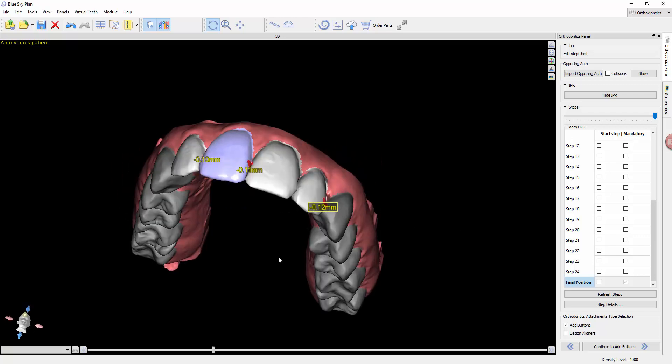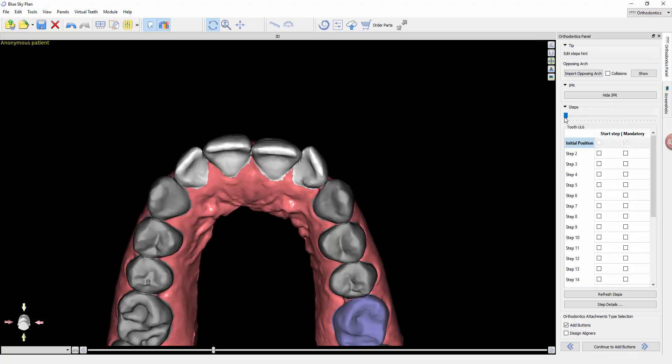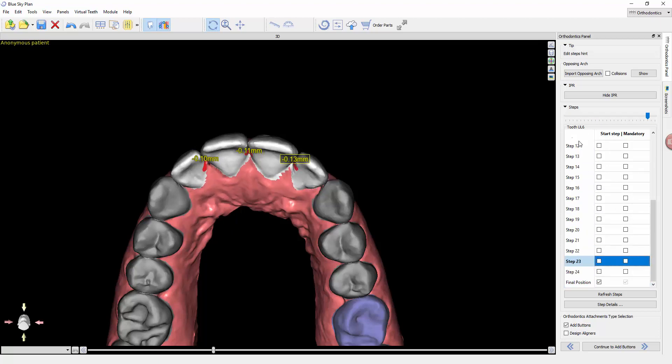This step of the process is fairly straightforward, and it's going to allow us to evaluate the progress of movement. Up here, if you hover your mouse and click right and left, you can see the teeth progressively move into position. You can see the various steps — going up and down through here, you'll see that we start with an initial position.